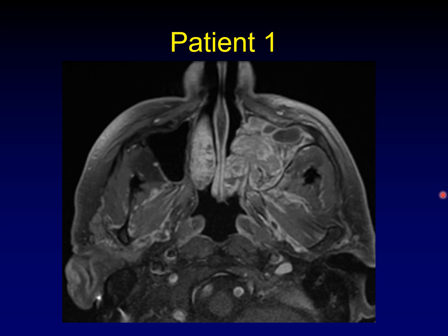This is the key image for patient number one. This type of enhancement that we're seeing within the mass is called cerebriform enhancement, and it's associated with a very particular entity: inverted papilloma. This mass arises in the lateral wall of the nasal cavity or the medial wall of the maxillary sinus. It extends both into the sinus and into the nasal cavity. This mass will sometimes have characteristic calcifications, but not always. Importantly, inverted papillomas may de-differentiate into squamous cell carcinoma, so it's important that they be removed.